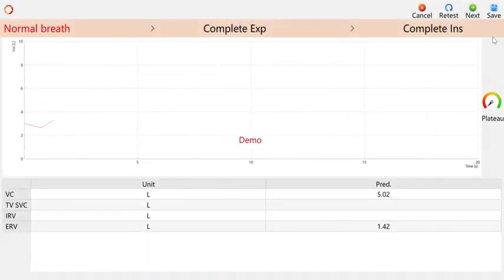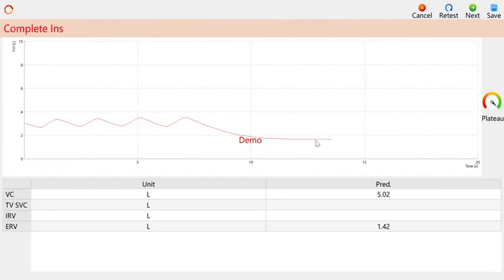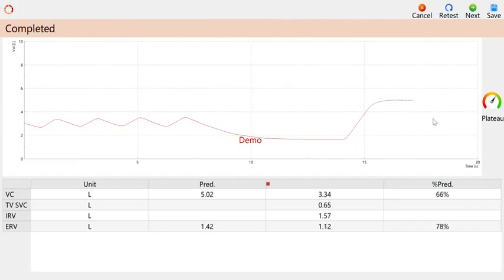The patient begins to breathe normally. After 4 to 5 normal circulation breaths, he enters full exhalation. Full exhalation is slow exhalation, maintaining the normal exhalation rate until all the air in the lungs is exhaled. When the expiratory curve is in a stable period, you can enter full inhalation. Complete inhalation is a slow process until the lungs are filled with air, and the curve appears a stable period.